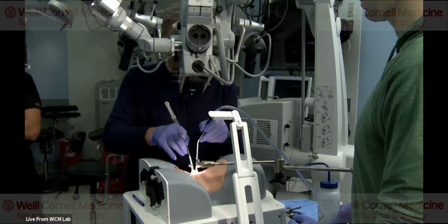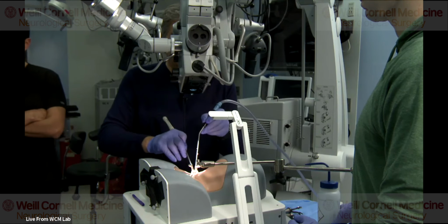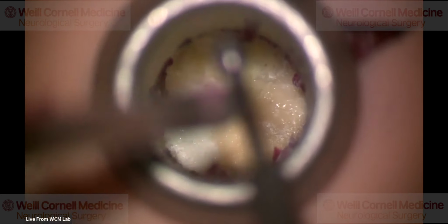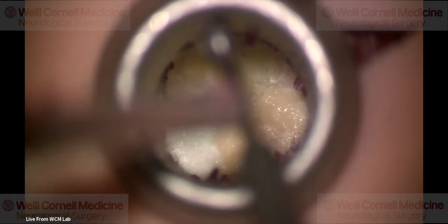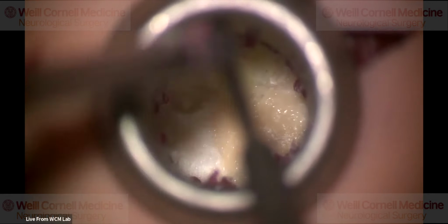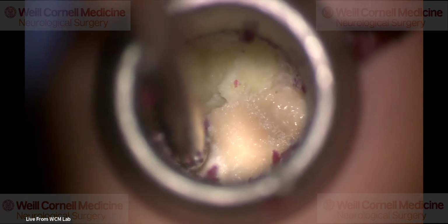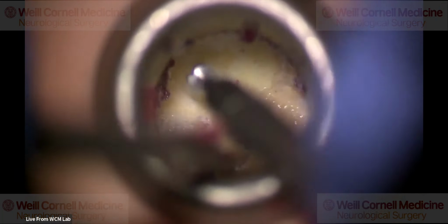And then I also put my fingers or my hand on the patient's skin if possible. The other thing that helps here is I pull out the drill bit almost a centimeter. You can have the drill bit here, or here, or here. I don't like the drill bit right underneath the shaft. The downside is sometimes there's more scatter, but right now there's not, which is nice. Pulling it out that far allows me to look around it and really see what I'm doing. Now I know from the navigation that the pedicle is going to be right there. So I'm just drilling down the bone.